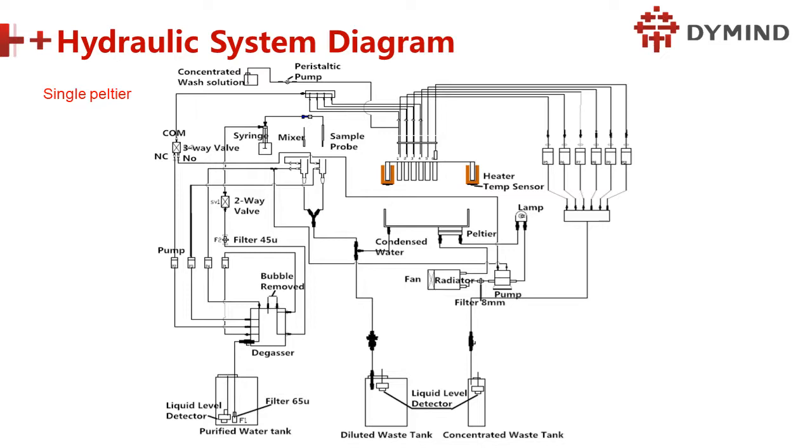But before that, cleaning the probe, right? So we need the wash well. You can see the wash well. We need to clean the probe here. After cleaning, then taking the sample, and taking the reagent from that disk, right? We have another disk. So the blood sample is put inside, and then cleaning, and then go to the reagent sample and take the reagent into the cuvette. After that, we use this mixer, put it inside for mixing, right? Okay, then measuring. After mixing, we do measuring. After measuring, we do cleaning, right?